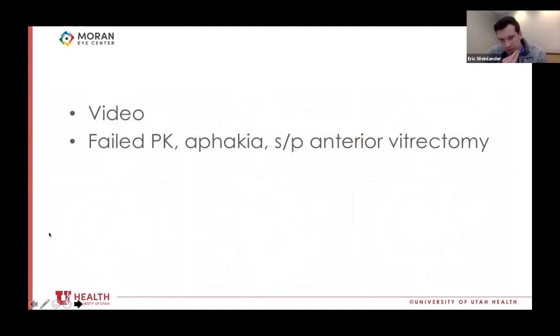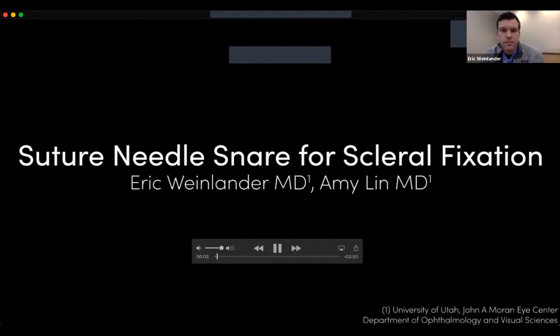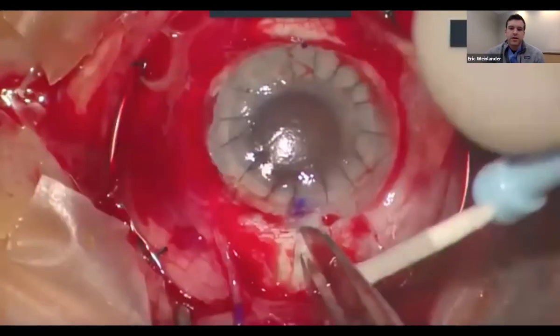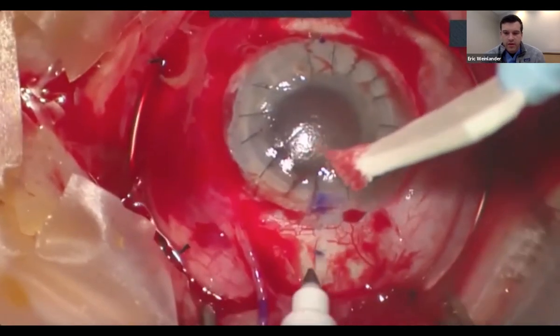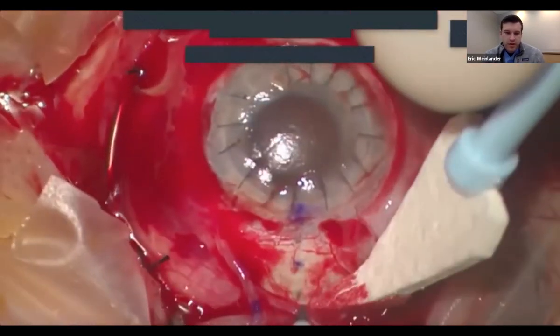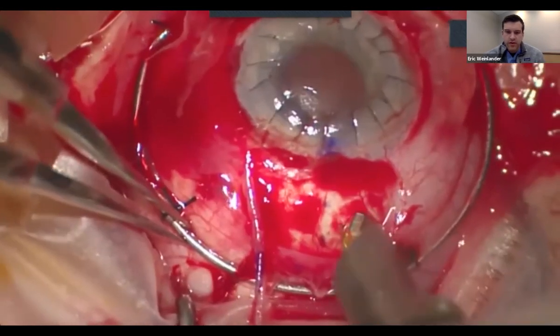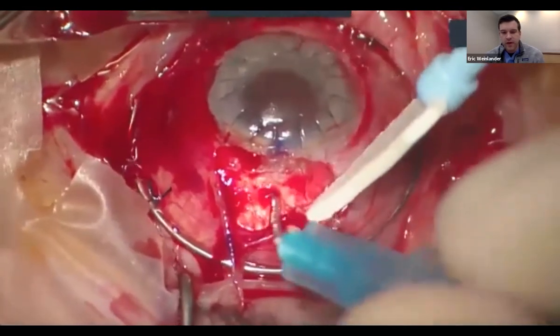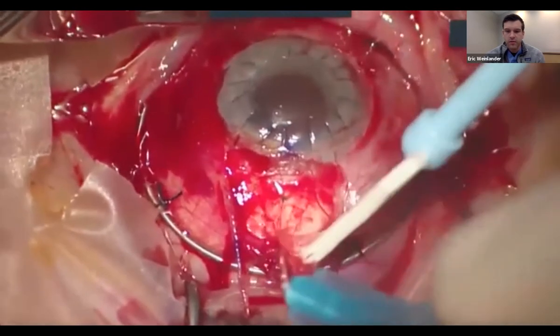To help visualize this, here is a video from a case. This is an older gentleman who initially had a PK for post-LASIK ectasia which subsequently failed and was left aphakic. We start by marking two points 180 degrees apart, with marks at 1.5 and 3 to 3.5 millimeters back from the surgical limbus. We're doing this in a radial fashion. For the Bausch NLOM MX-60 lens, radial fixation reduces or eliminates concerns of lens tilt.